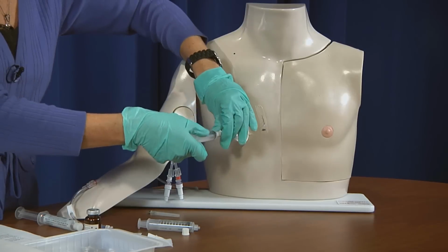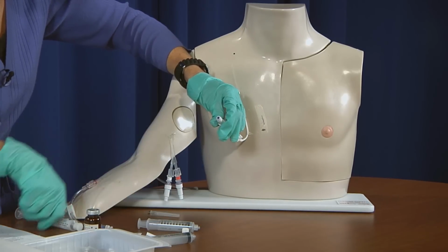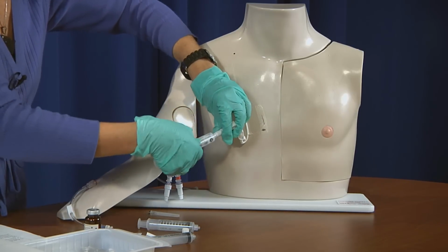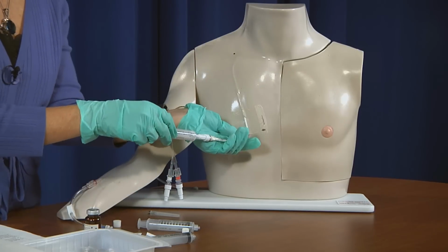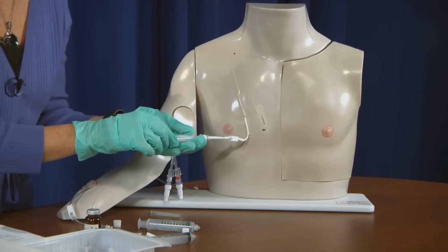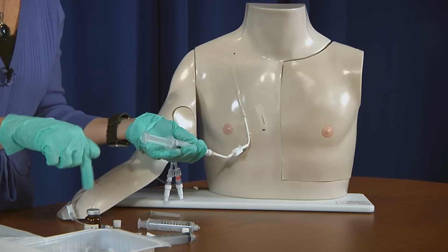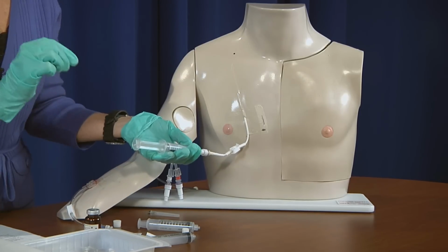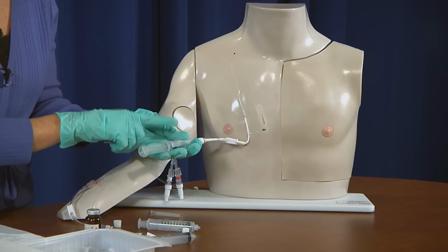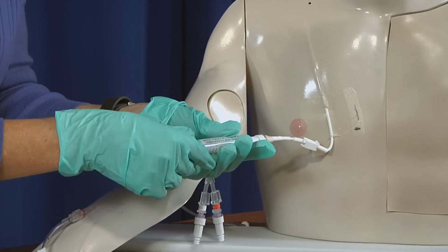Now, again, we are not going to have to wipe again, so we're going to go from one to the next without letting anything touch my port. And then we're going to flush. Now, the main thing here that you tell your instructor is you're going to flush the same amount of time that you had to push your medication in. So if you had to push your medication in 1 cc over 1 minute, guess what I'm pushing my flush in? 1 cc over 1 minute, because you still have all this medication in here. And we don't want to give it fast if it's not supposed to be given fast.